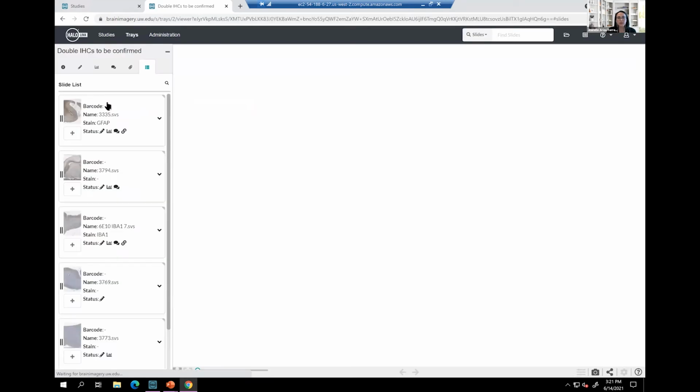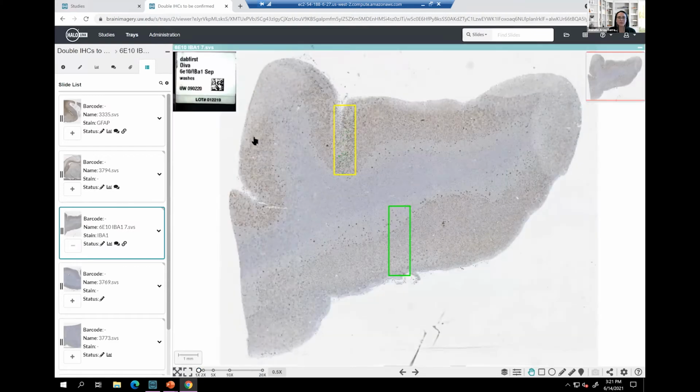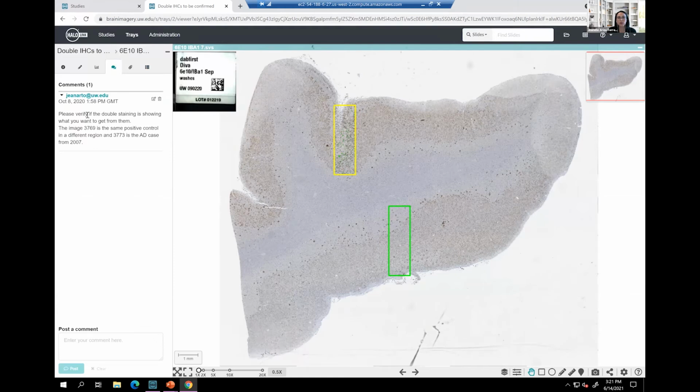So when you do that, you are able to start seeing those images and start commenting on them. For example, in this dialog box, I can comment, ask questions, ask suggestions, and use the annotations or the analysis to interact in a specific and organized way with my collaborators.